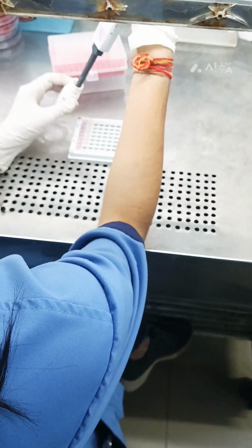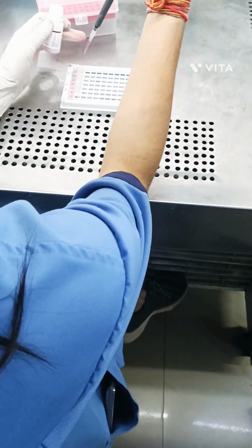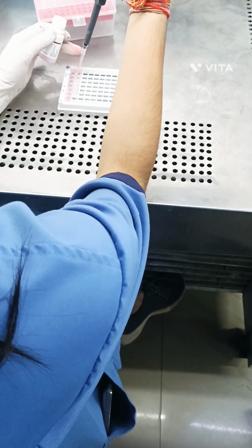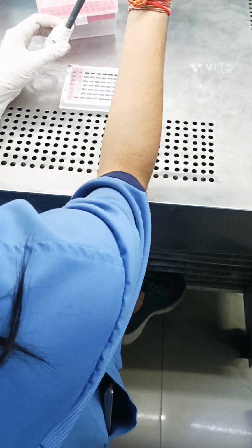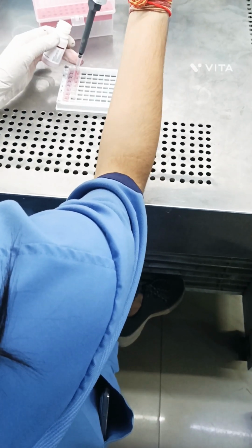After 1 hour of incubation, pour 50 microliter HRP conjugate in all wells, standard also and sample also.